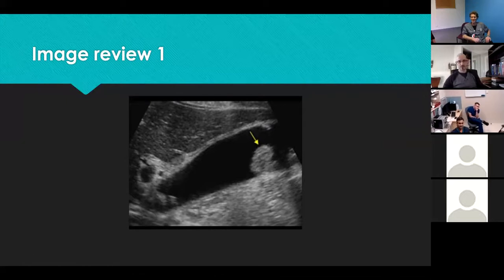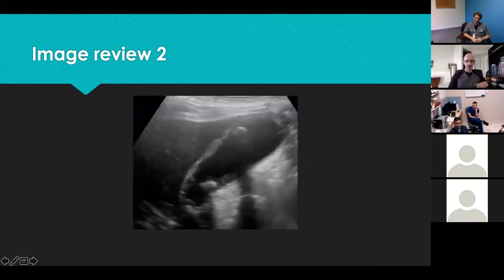Perfect. So pretty much, I don't have anything to add. That was a pretty good answer, Ravi. Yeah, it was a perfect answer. To be honest, I don't have anything to add. So an echogenic structure with no shadow after it, as you mentioned, can be either malignancy or sludge ball or a big polyp. You can move the patient, see if it moves. You can put some color Doppler on it, see if it has some flow.